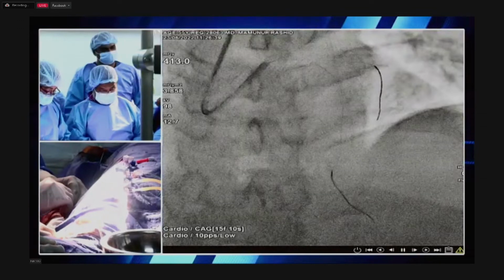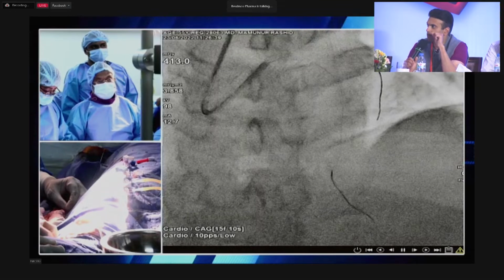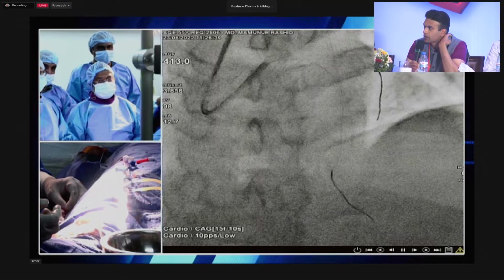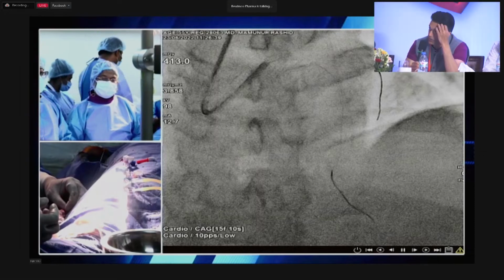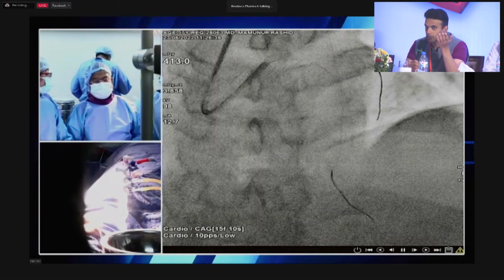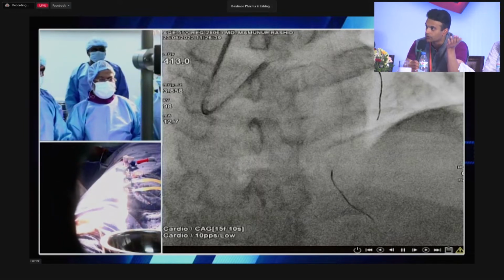I mean, I think the crossover strategy from the LAD to the left main is an agreed upon strategy. I think I'm looking back at the panel, and I don't see any disagreements. Your landing zone was great. It's a 3.91 millimeter EEL to EEL landing zone, but your left main is 5. So you're going to have to select a stent platform after you predilate that's going to reflect the ability to expand across those things. And this may require some of the experience that you've so capably demonstrated so many times with a 4.0 stent that's a little bit underdeployed at the distal end, but because of the additional connectors, allows you to post-dilate to a size over 5.